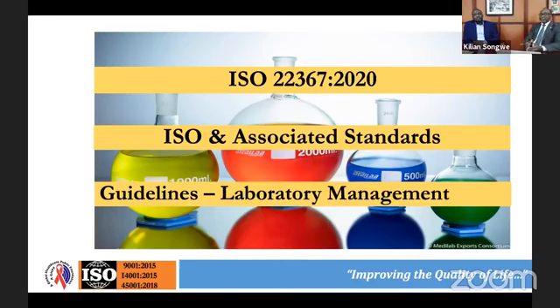Whether you're doing verification, ensuring that whatever the manufacturer told you is what you get, or whether you're doing a validation because you are acting out of a standard method. But as we go on, we're also going to have the discussion about measurement uncertainty, which is also another big element that has a huge play when you're talking about verification and validation, but also when you're looking at your relationship between external quality assurance and internal quality controls. That element of measurement uncertainty is an area which we need to look into because it has huge relevance.